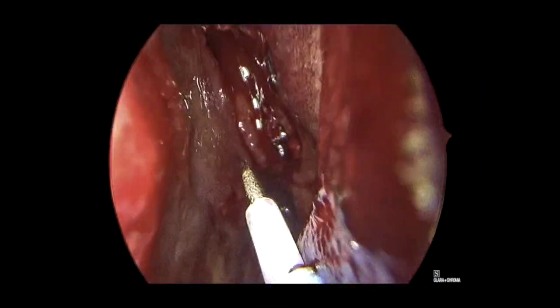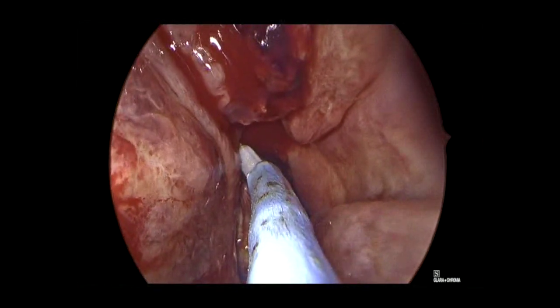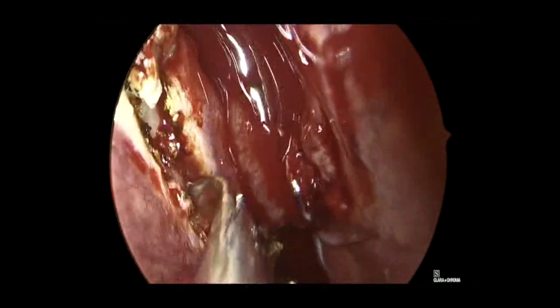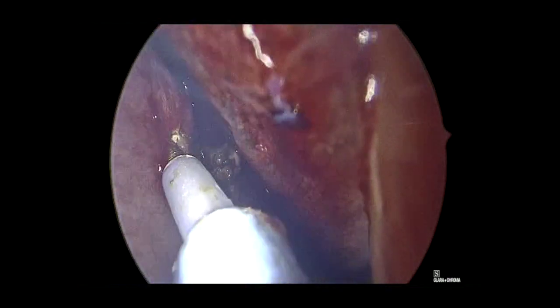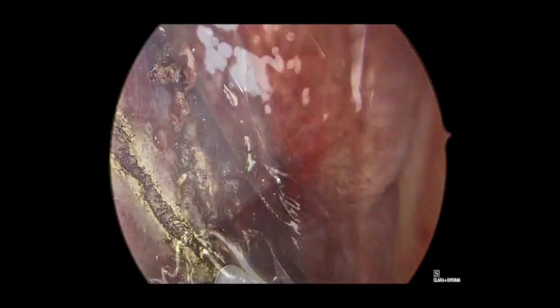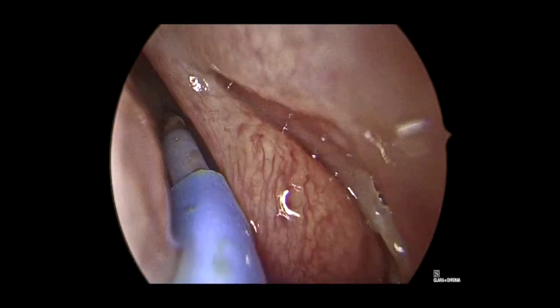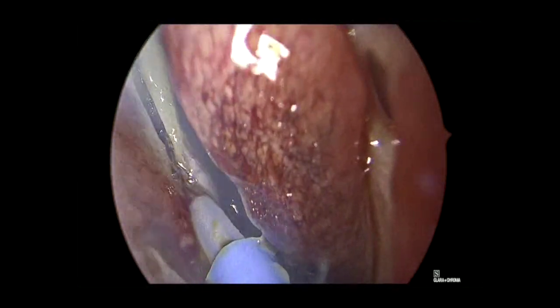Now here we are turning our attention to the patient's left side. As mentioned earlier, the tumor is a bit more involving the left than the right. We don't need a flap on this side, so we make a wider incision on the nasal septum around the tumor. We will sample margins from the nasal septum side to ensure that we're clear. This also gives us our inferior aspect for our cranial base resection as we take these margins out and eventually take out the whole back of the nasal septum. Here we are taking that superior portion of the margins on the patient's left side, on the nasal septum, up towards the anterior cranial fossa.